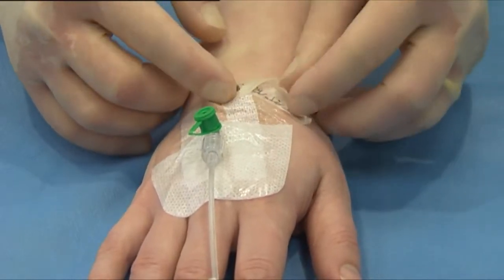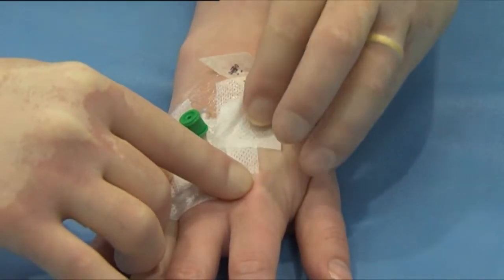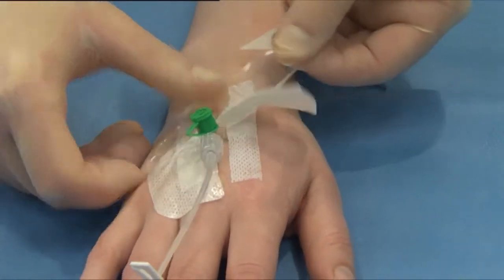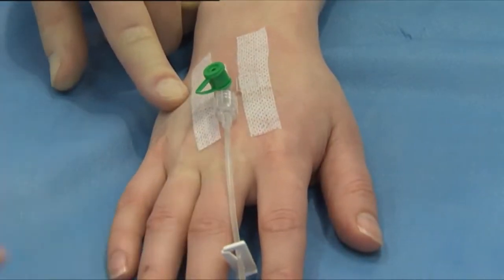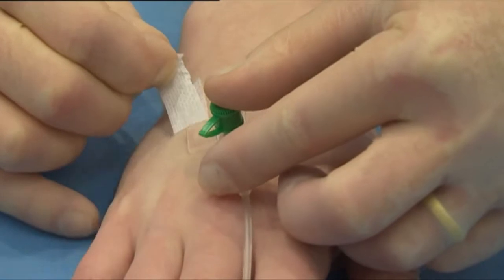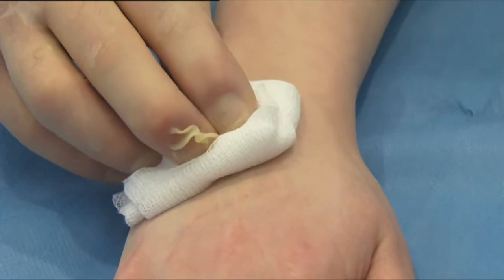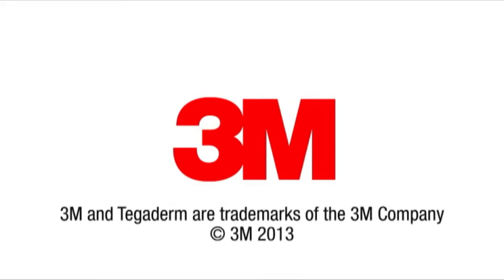Remove the date record label from the edge of the dressing. Carefully peel back the soft cloth tape section using a low and slow technique. Alternately stretch and release the film section parallel to the skin to break the adhesive bond. Carefully remove the securing strips whilst holding the catheter in place.